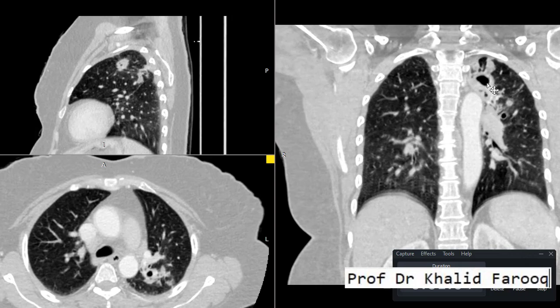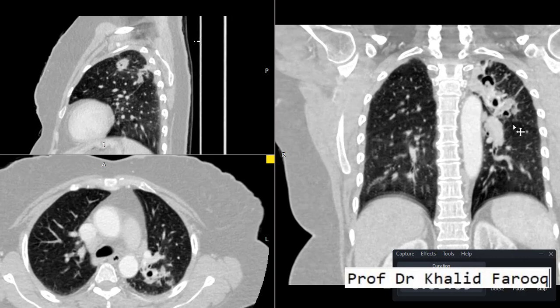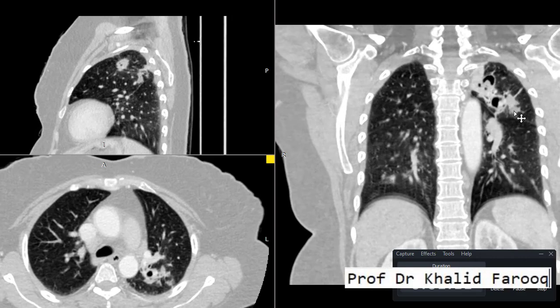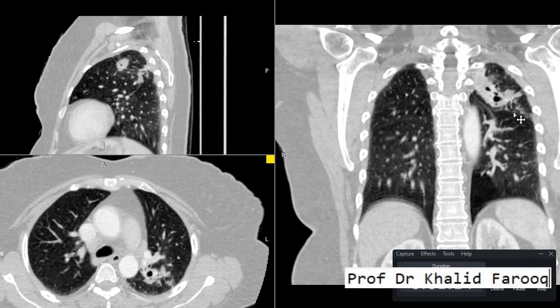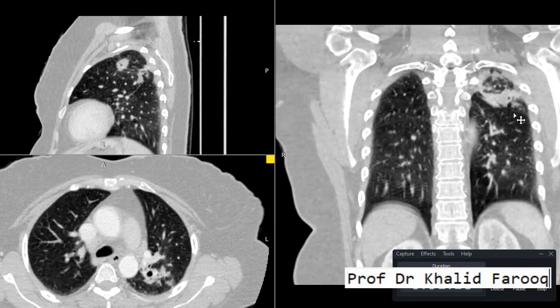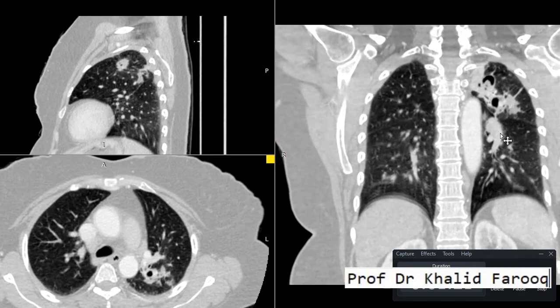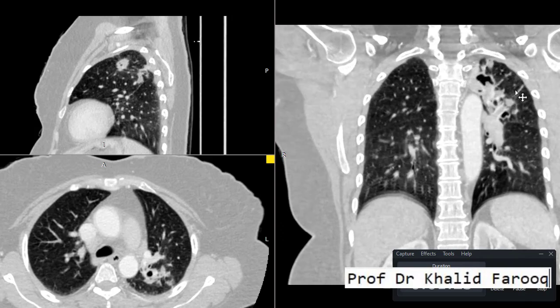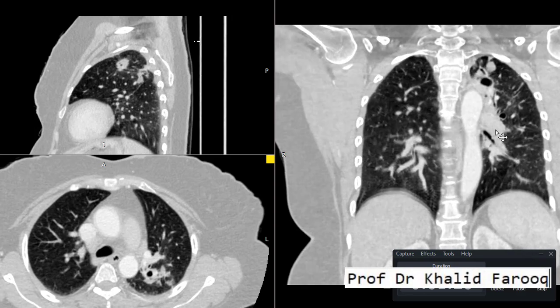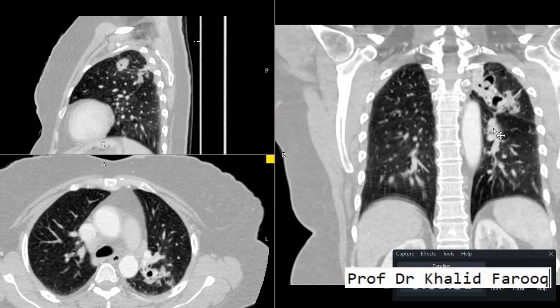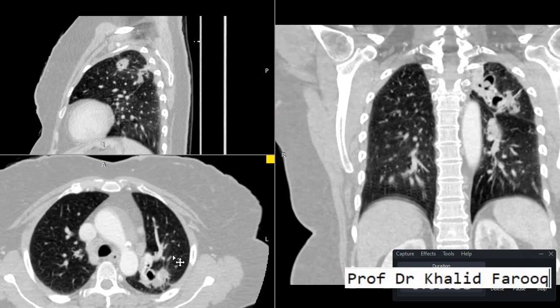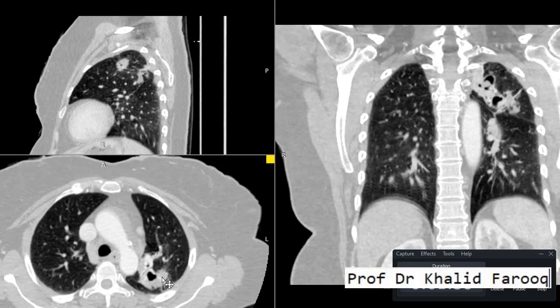Here we can see irregular thick-walled cavities with surrounding variable-sized nodules and apical pleural thickening. We can see fibrotic changes around the above-described cavities and nodules. This can be confirmed on axial images as well, where we can see the irregular thick-walled cavities.